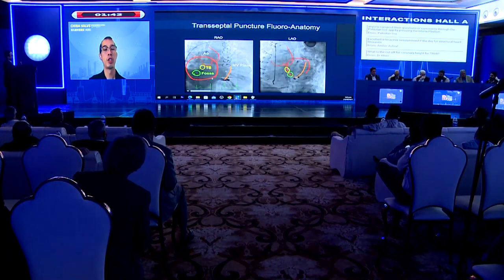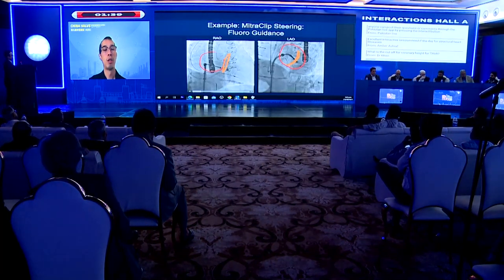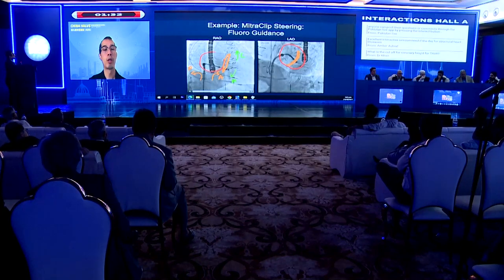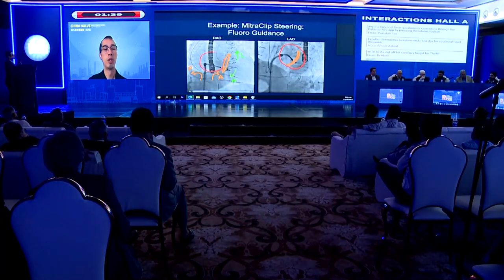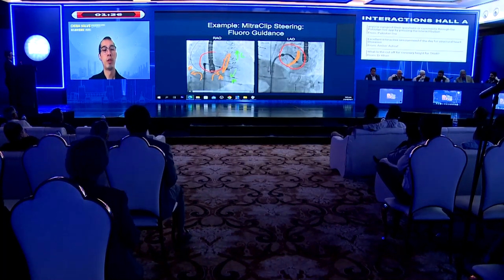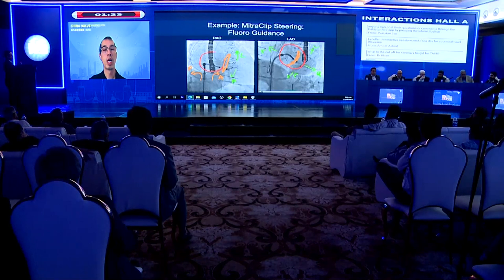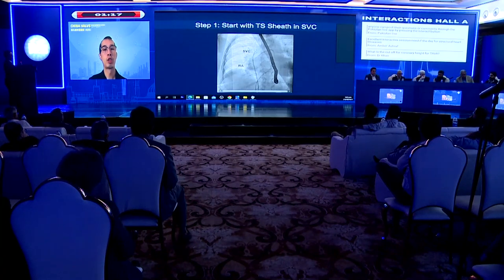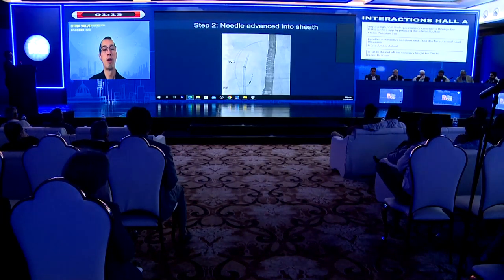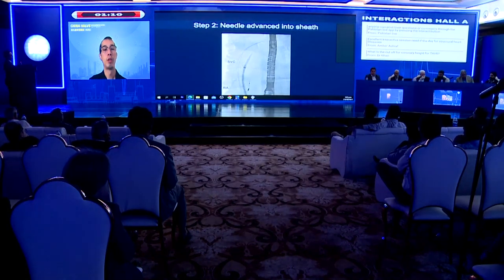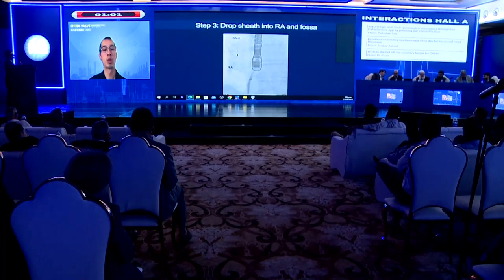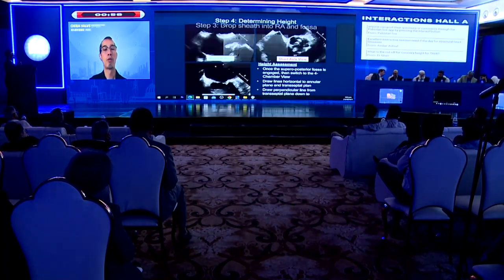An example is shown with an ASD device and two clips visible. On the RAO view, posterior movement to gain height goes to the left side of the screen; on LAO, the direction is confirmed. Inside the transeptal sheath from the SVC, the 0.032-inch wire is advanced, then the needle is advanced near the tip of the dilator. The assembly is then pulled down, and the RAO projection is used to see how anterior the needle is. The characteristic 'drop' is looked for on both echo and fluoroscopy as the needle tents the fossa ovalis.